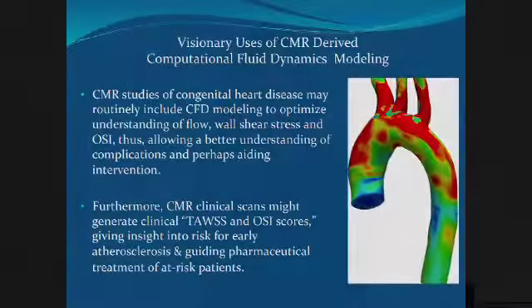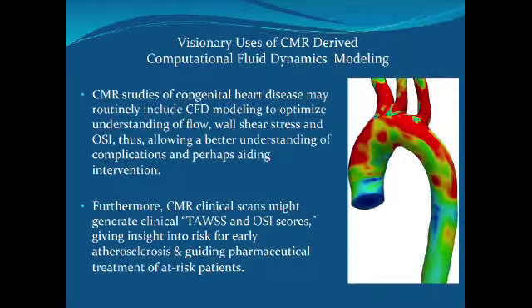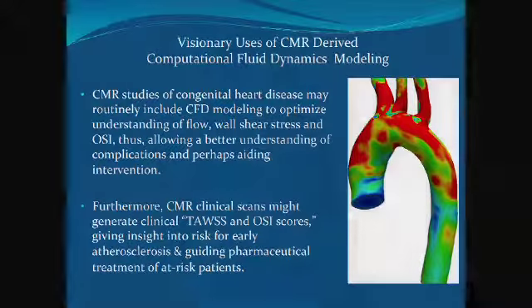So very interesting. I could imagine 20 years from now, when I'm retired and my child is maybe going to engineering school, that one could use CMR studies of congenital heart disease, yes, to get anatomy, but maybe to include computational modeling on all of them to allow us to understand flow, wall shear stress, and oscillatory shear index, and then allow a better understanding of the complications that happen from surgery or from disease, and perhaps aid in intervention, as shown with that early Fontan picture.